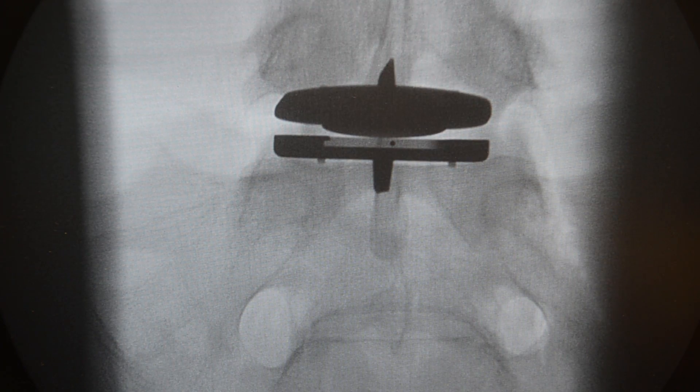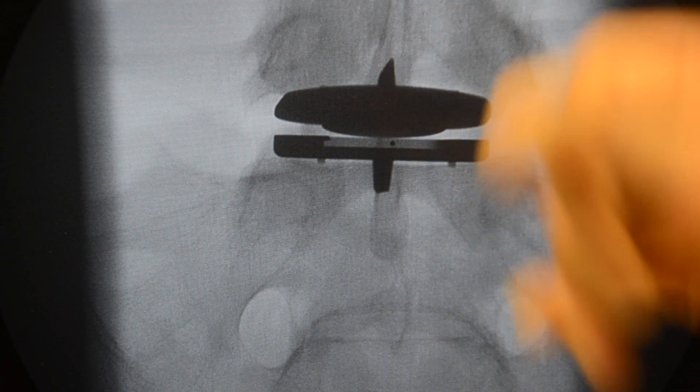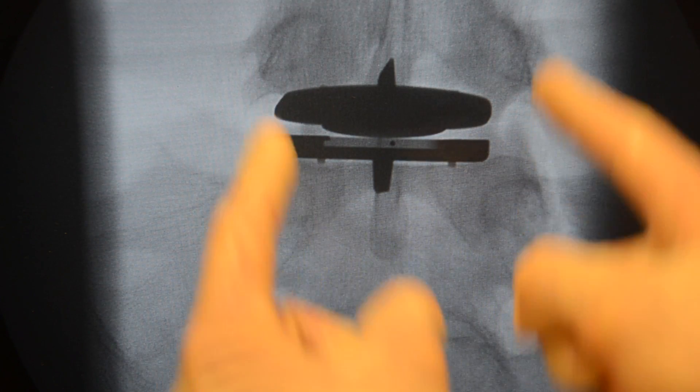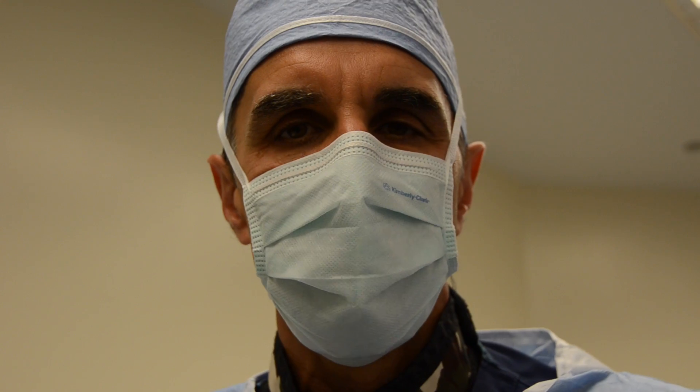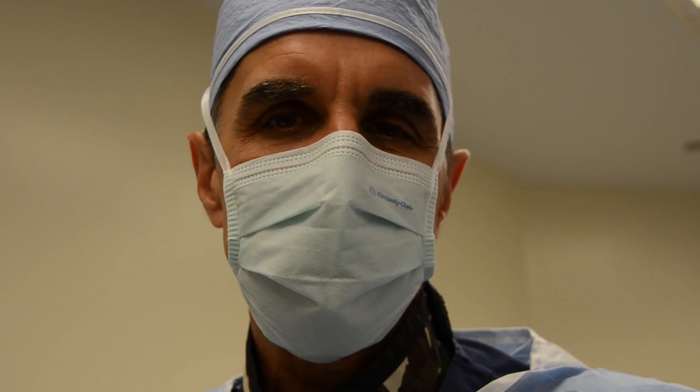The end plates are flush with the true end plates. The core is in position — it looks good. Here's an AP view. You can see the keels lined up with the midline, the disc within the pedicle. Everything's positioned properly. Motion preservation surgery — disc arthroplasty L5S1.